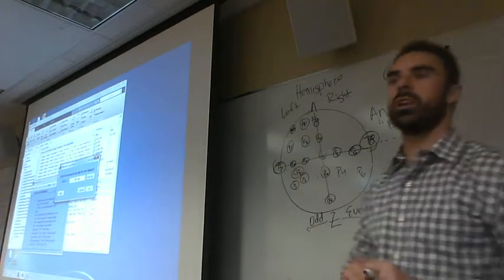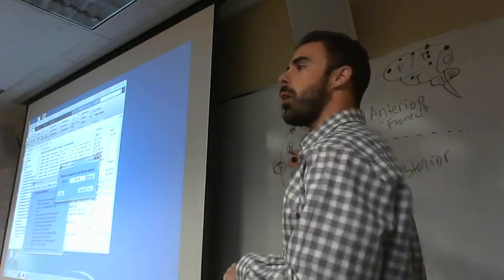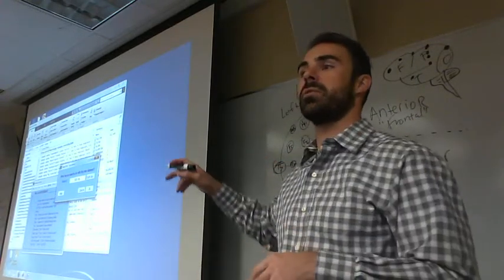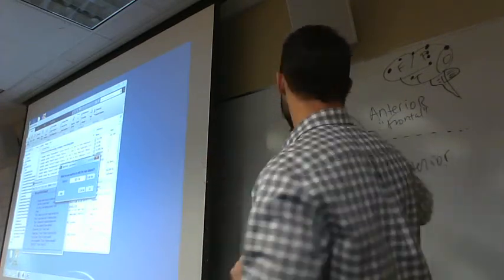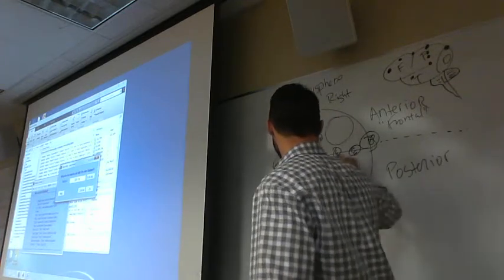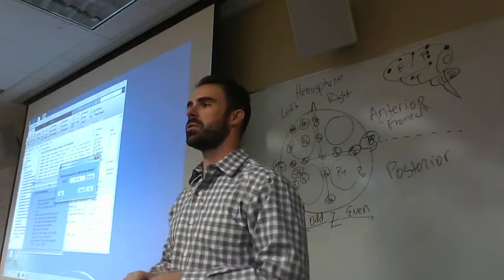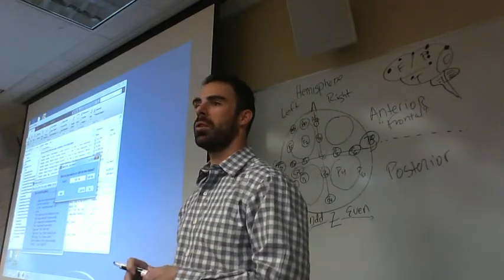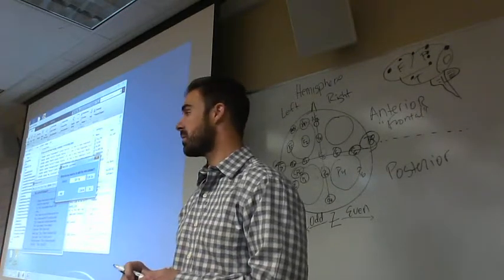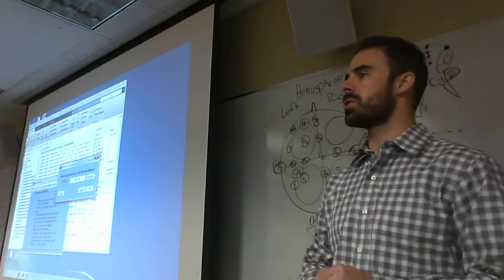Later on we'll talk about topographic analyses, where you start to look at how patterns of electrical activity at the scalp can be differentially identified and statistically dissociable based on where they are. So you classify, say, these 4 quadrants, and you could aggregate and average all those electrodes together, and then statistically compare activity in the right frontal hemisphere versus the left posterior hemisphere, and things like that. You can start to see some spatial dissociability there. Any questions on the 10-20 system?